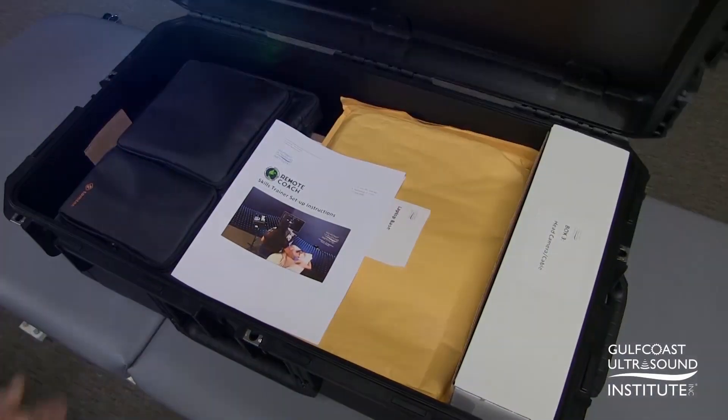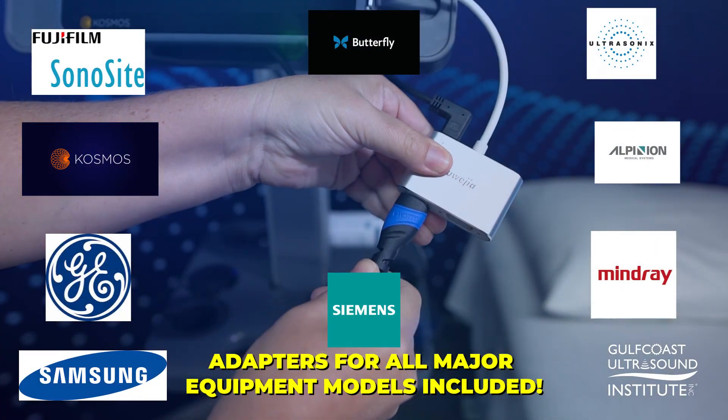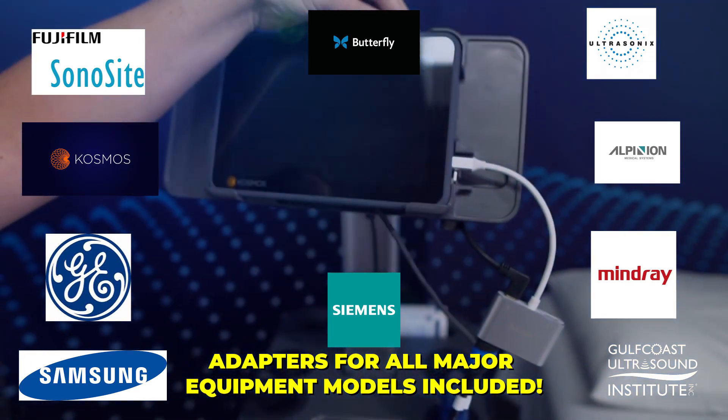The Remote Coach Virtual Skills Trainer Kit contains everything you need to get set up for your scheduled hands-on training session and is compatible with most current ultrasound equipment models.